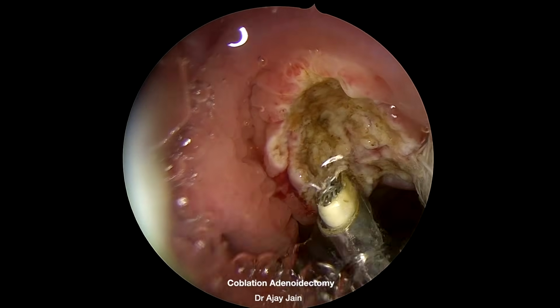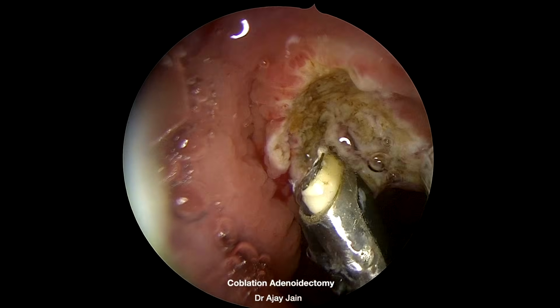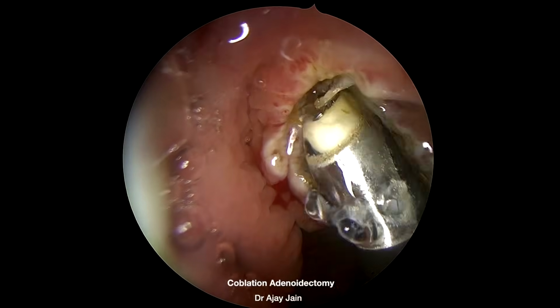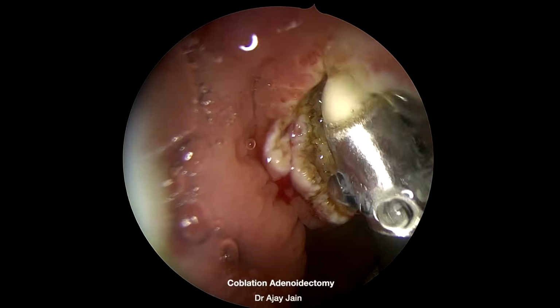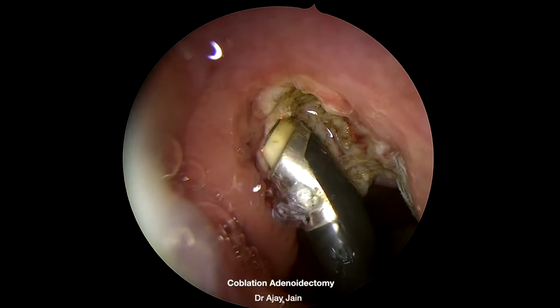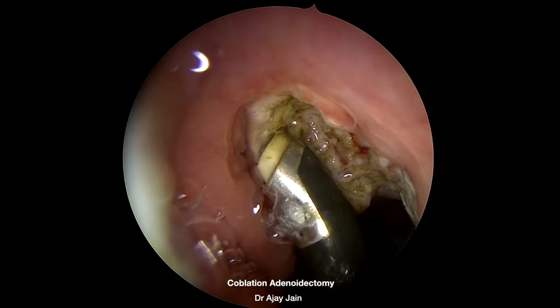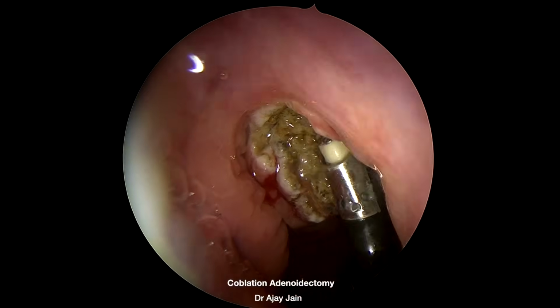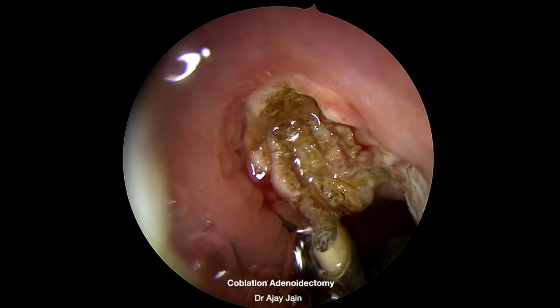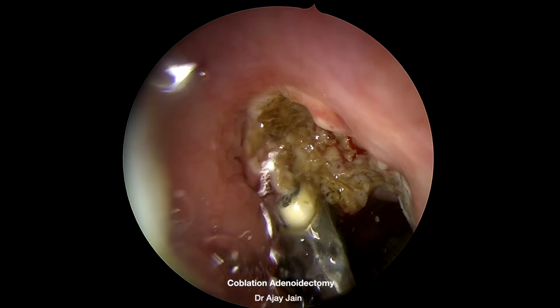At this stage, only a thin remnant of adenoid tissue remains. There is virtually no smoke, no charring, and excellent visualization is there all the time, thanks to the continuous irrigation by the wand and with the help of my assistant who keeps flushing intermittently.